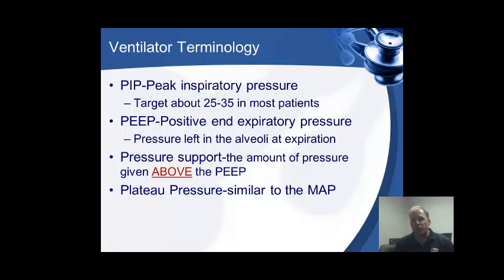Now, pressure support. This is something that a lot of people don't really understand very well, but it's not that hard to get. Pressure support is in those modes where we're doing bilevel or BiPAP type ventilations, or we're doing SIMV, which is a synchronized mode of breathing with a patient that does have a respiratory effort. And we give them a little bit more pressure so that they can get a good volume in every time they take a breath. Just a supportive mode.